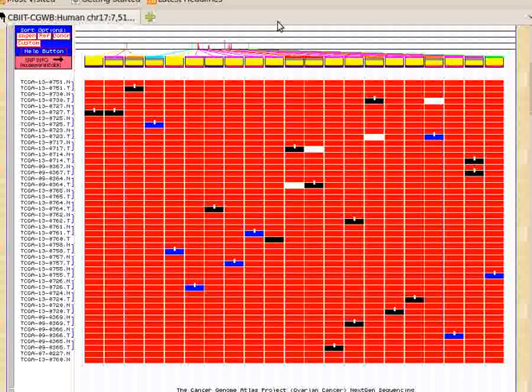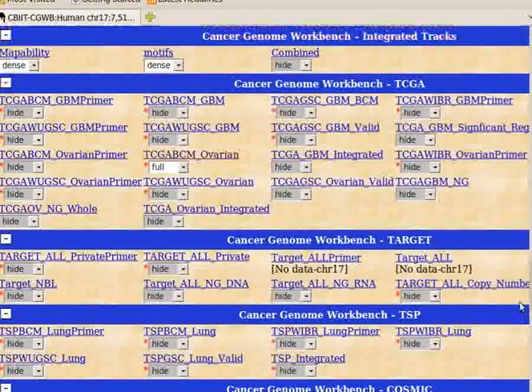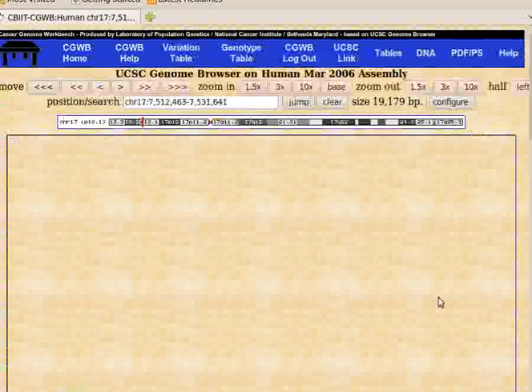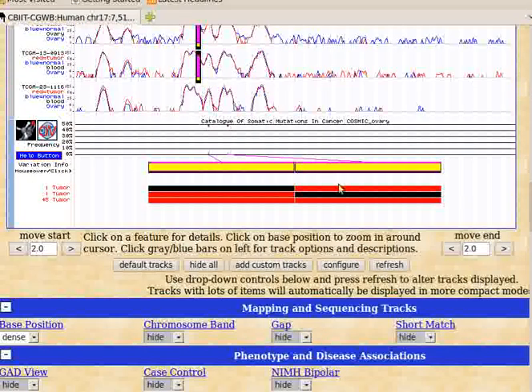So one of the advantages of having all these projects in place is we will be able to see how the other project, the ovarian cancer project, looks for the ovarian P53 mutation. And here's an example where we have the Cosmic ovarian cancer, which is in pack mode. This one summarizes the numbers of the samples that have some mutations and displays them along with those that do not. So we are seeing that in Cosmic ovary, we have very few, 2 out of the 45 that have somatic mutations for P53. This is a lot lower than what we are observing in TCGA ovarian cancer.